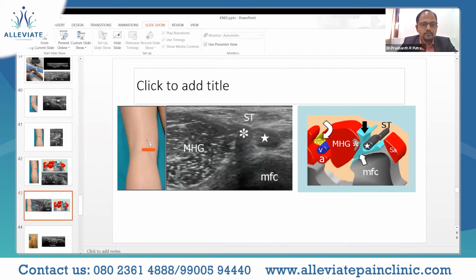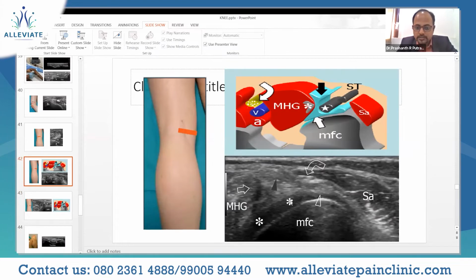So now we have come a little inferior, where you are able to visualize the medial head of gastrocnemius. Again, to talk about the bursal location over here, which is not seen, the bursal location is located between the 2 tendons, semimembranosus, semitendinosus, and the medial head of gastrocnemius. We have the tendon over here. And another hypoechoic structure which should not be missed is the articular cartilage, which is just above the medial femoral condyle, in this area.